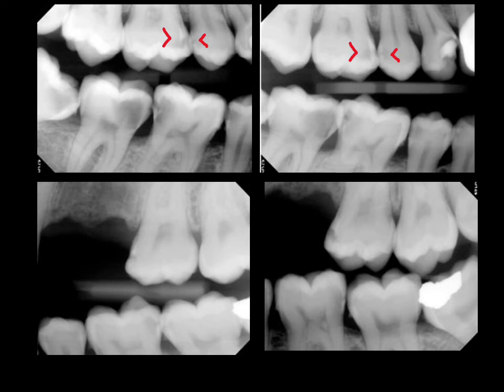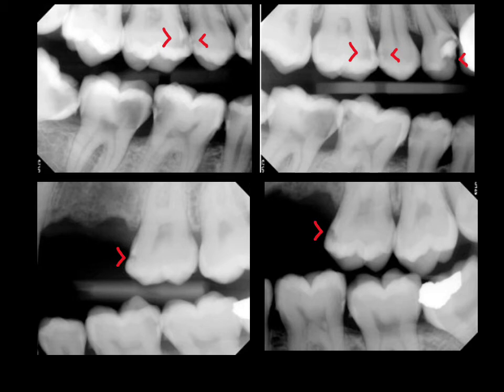There is obvious severe decay on the mesial of number five. Continuing over the maxilla, we can see decay on the mesial of number 14. The distal of number 14 is overlapped on that film, but we see it well in the next film, confirming that decay on the mesial of 14 is indeed true. Since number 13 is missing, we'll be able to look directly and with clinical vision and our explorer tell if that's truly decay.